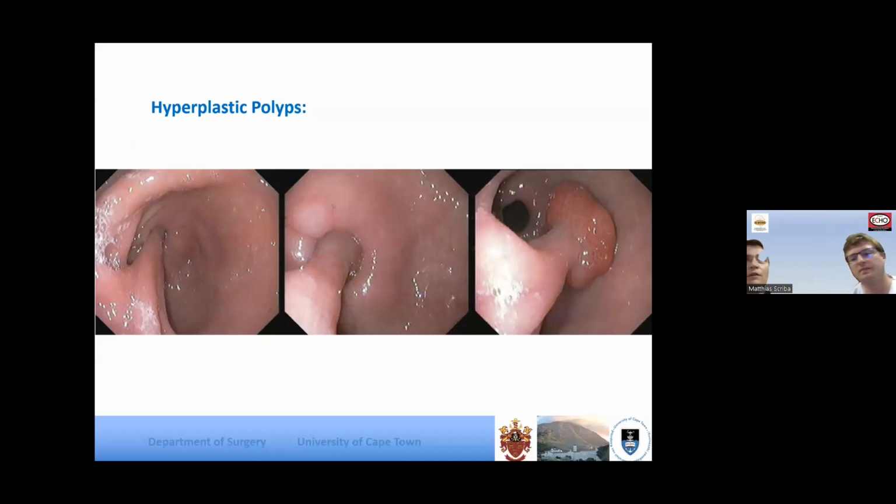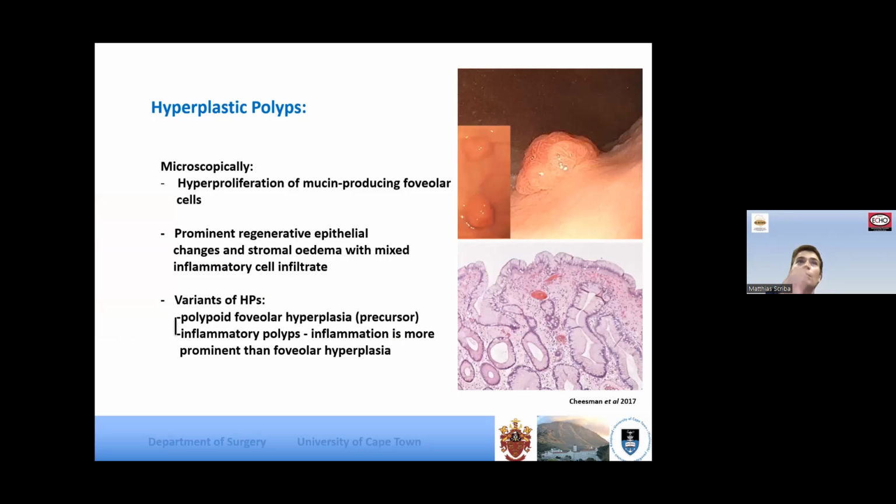Yeah, so as Matt said, the big solitary distal hyperplastic polyps can actually present with intermittent intussusception, vague epigastric pain, sometimes with vomiting immediately after a meal. And you can see it, it's sort of a ball valve effect happening there. And we've done a few patients like this. Matt will show you just now.